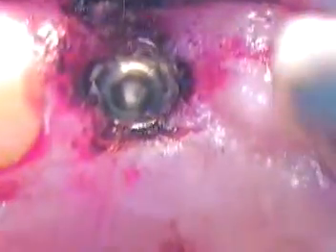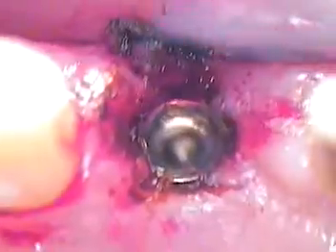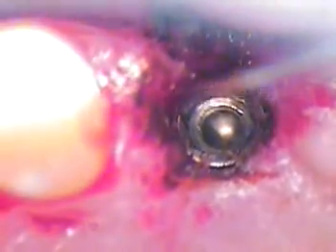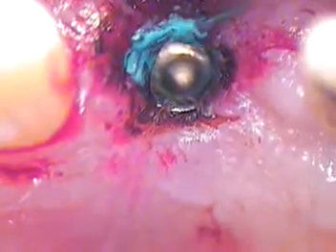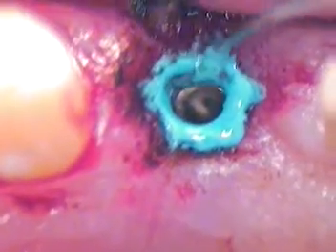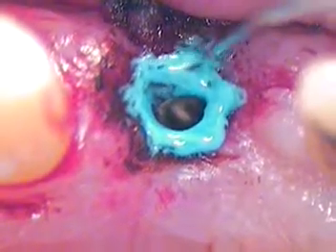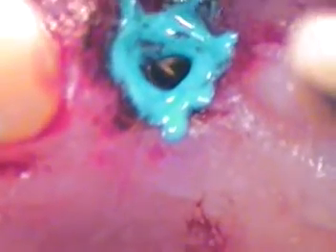Again, we don't want to trap anything underneath, so we know we've got that labial to retract lightly. Let's do this first before we do anything. We see that there's a piece right here. I'll go with the blue. Alright, so we're going to control the bleeding a little bit more. We'll use this blue material and apply that to the rim. Alright, and we'll drape that up here. Kind of headed off at the path, so to speak. Let's vacuum it away without rinsing it. So large suction tip again.